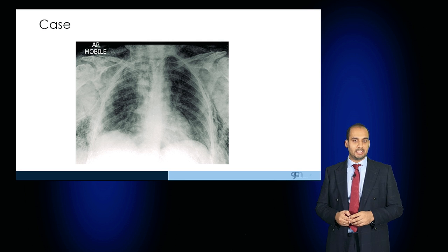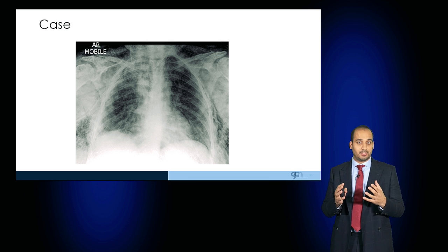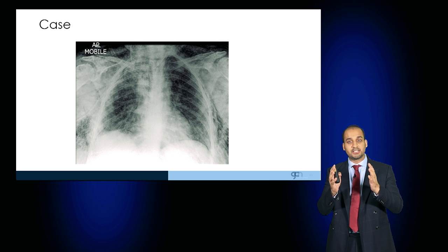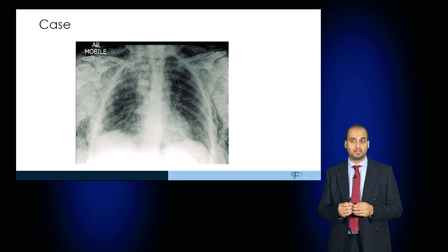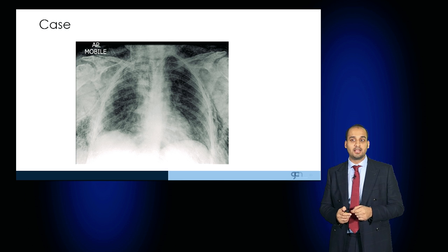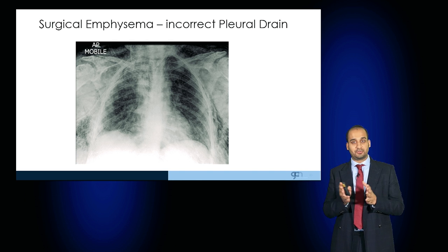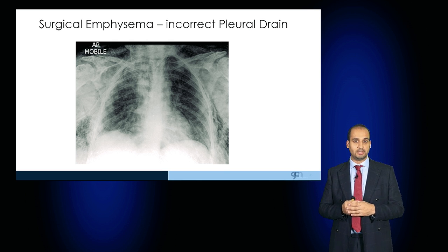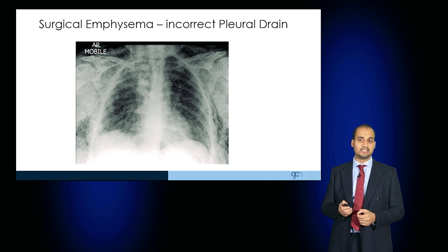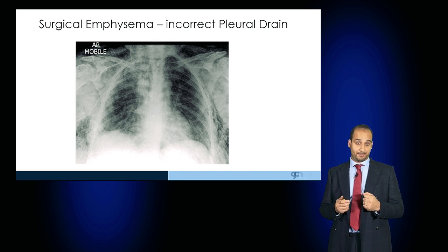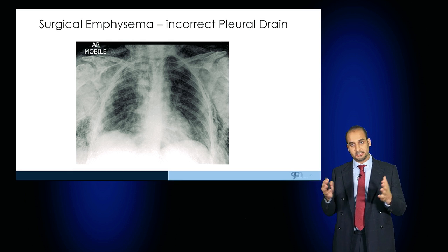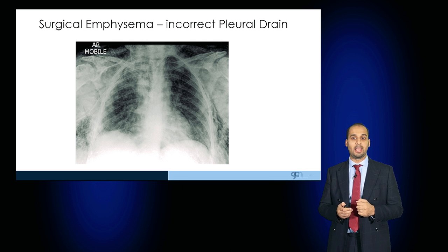The next case looks rather abnormal and has this patchy appearance, not only over the chest wall but outside of the chest wall as well. This is a case of surgical emphysema causing pleural air to be trapped in the subcutaneous tissues. This occurred as a result of an incorrectly sited pleural drain. If you palpate this patient, you'll notice a very crispy texture to the skin, suggestive of subcutaneous emphysema.